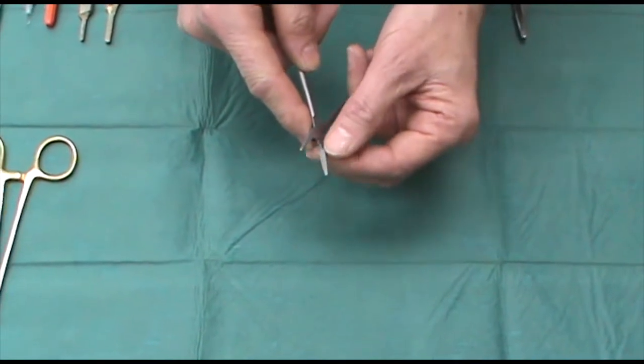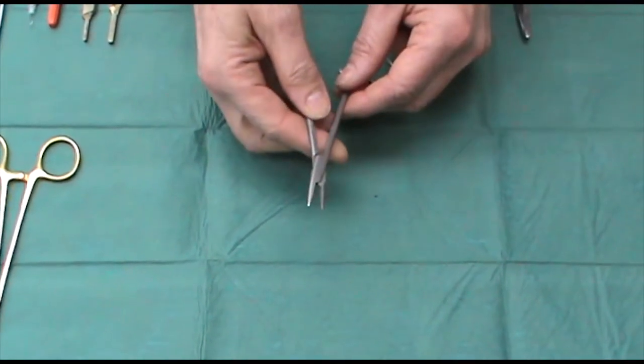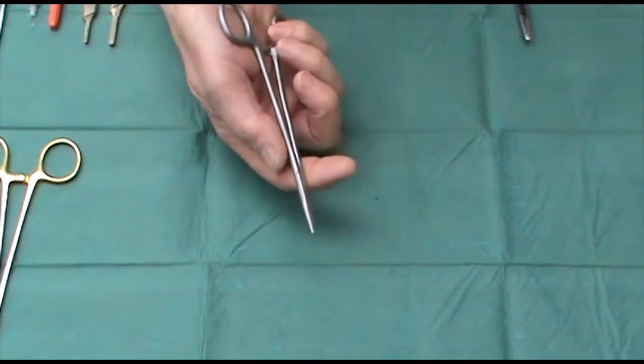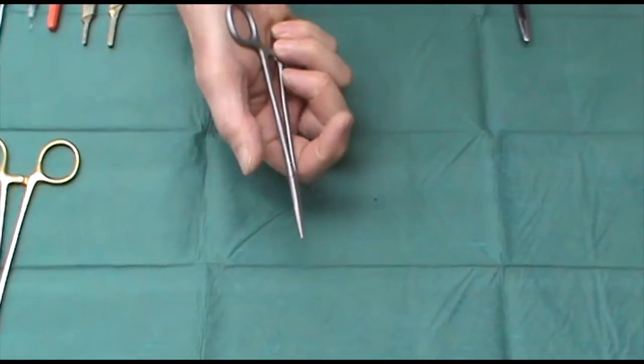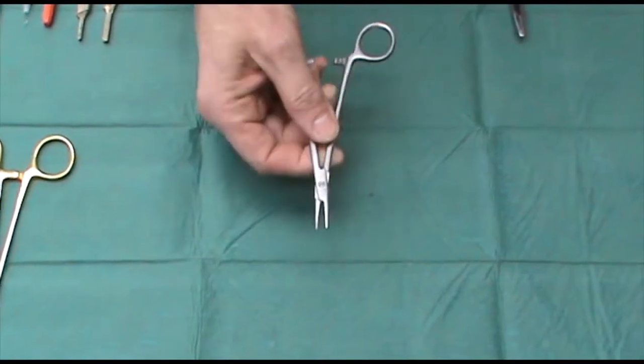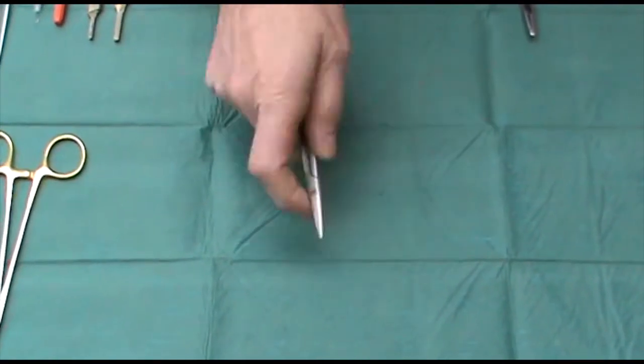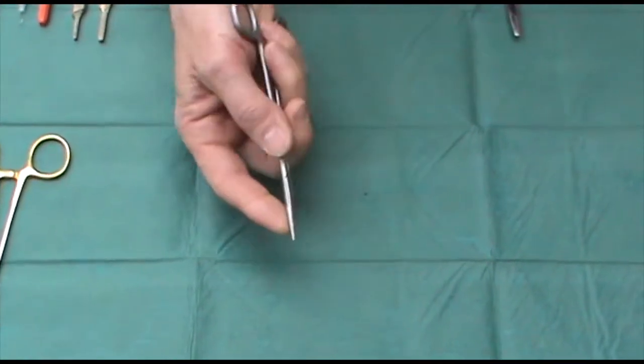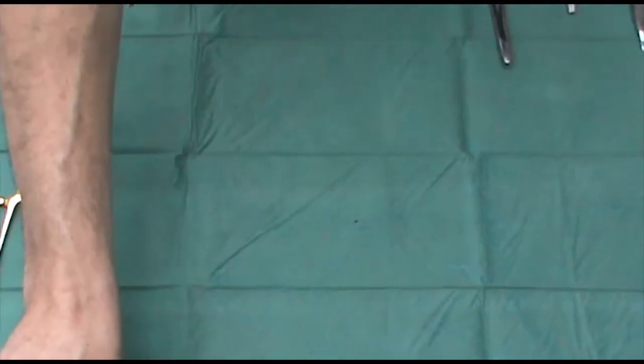These are much cruder in design and build. They have very rough toothed jaws, and the clip is nothing like as nice as on the reusable pair. But they're not bad, and they can at least enable you to hold them properly, even though they don't always hold the needle well.